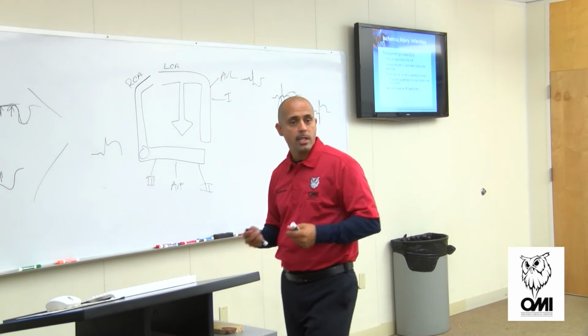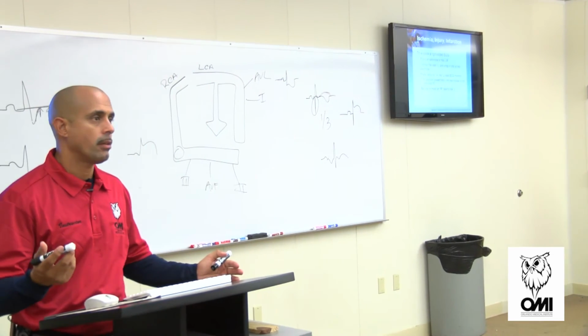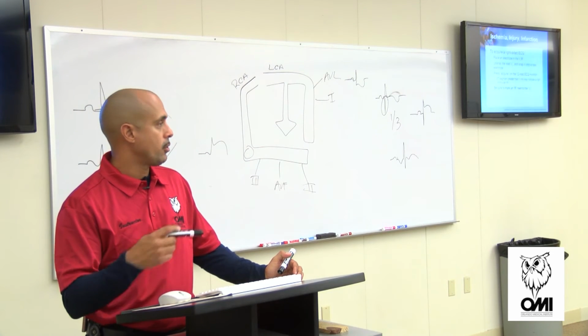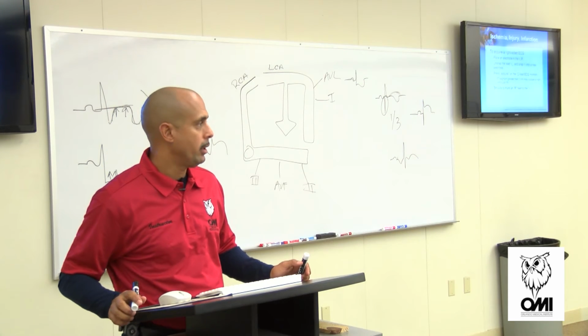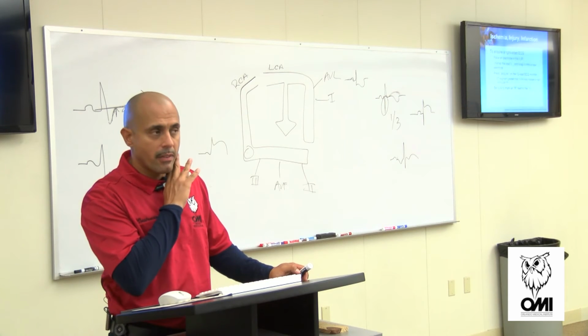And then once the fluid's up, that blood pressure's up, what can I give this patient at this time? Nitro. Do I want to give nitro with a low blood pressure? No. So before you give nitro, I do a V4R, confirm. And if it's involved, before I give nitro, I make sure IV is established so I can give fluid. If I can't get an IV, am I going to give the nitro? No, I've got to make sure the IV is established.